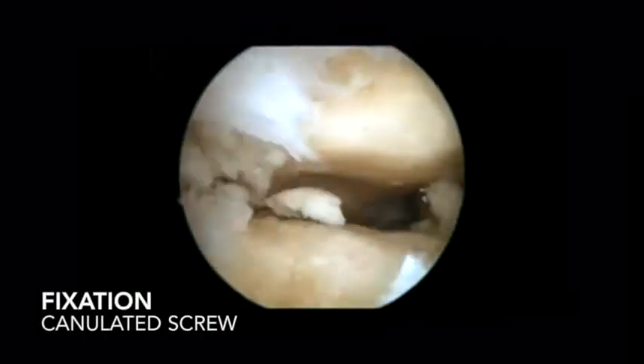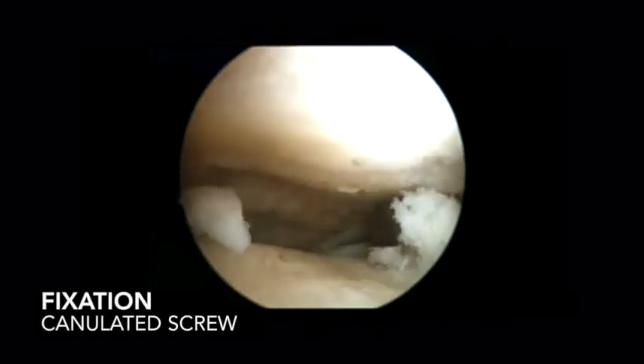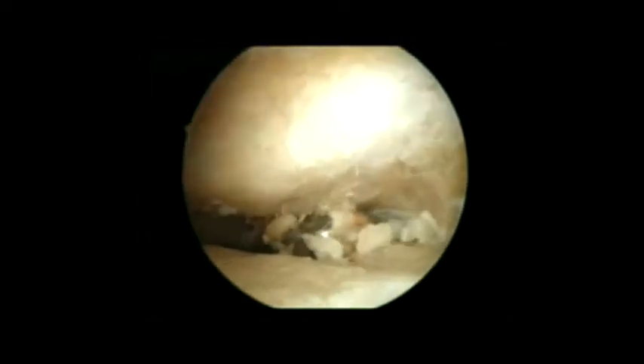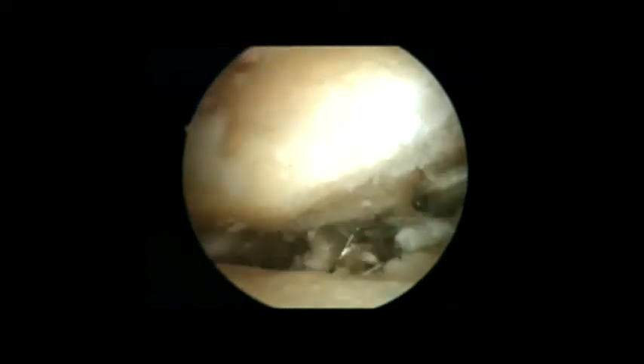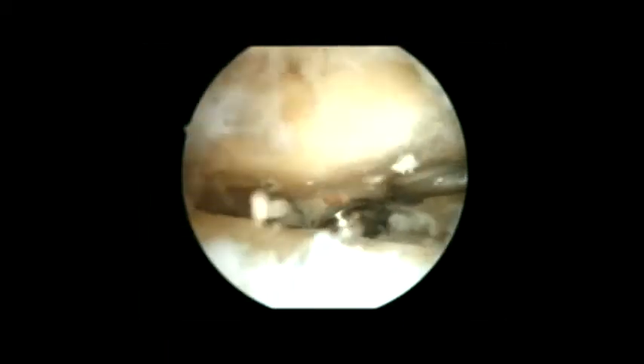We are able to correct varus or valgus deformities under 10 degrees by milling over the lateral or medial sides respectively. We prepare the joint surfaces using small chisels, curettes, shavers, and spherical burrs. The instruments must be suitable for small joints to access the entire articular surface. No method of joint distraction is used.